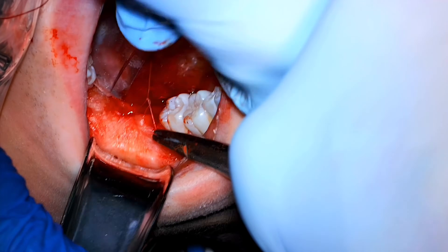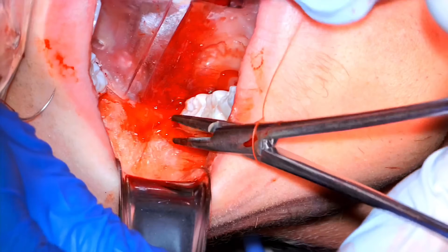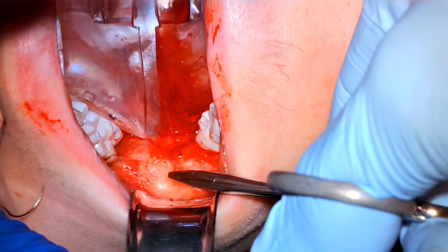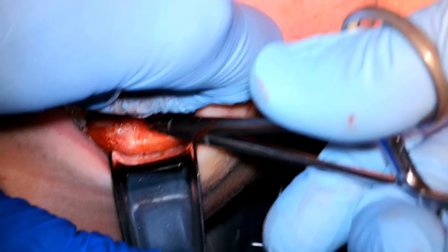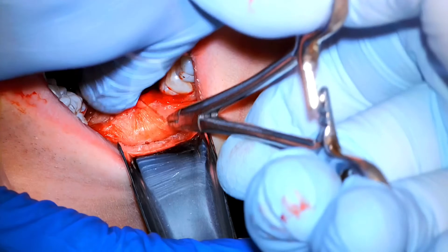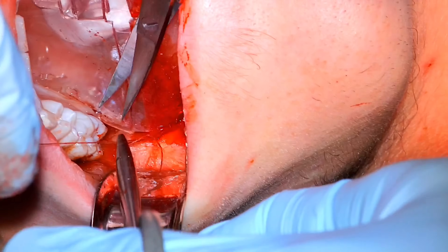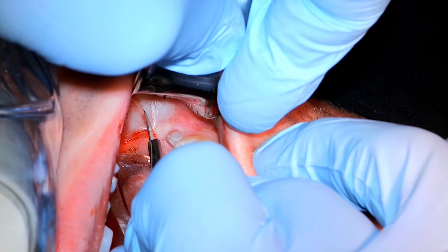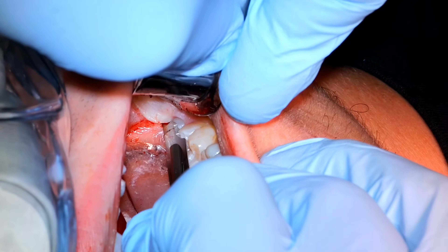Just checking the needle holder — sometimes you get a little fragment of suture in there that makes things slip a bit. I'm just cinching up the suture with one more throw to make sure everything is good. These knots tend to stay tied pretty well. As for 3-0 versus 4-0 — I don't find a huge difference. I used to lean more toward the 3-0, thinking I'd need more tensile strength back there, but they both seem to hold up really well as long as you get your knots tied tight.